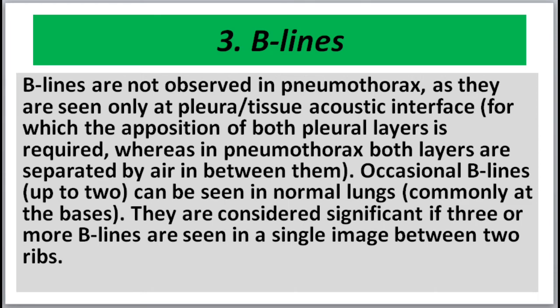B lines are not observed in pneumothorax, as they are seen only at a pleura-tissue acoustic interface, which requires apposition of both pleural layers. In pneumothorax, both layers are separated by air. Occasional B lines — up to two — can be seen in normal lungs, commonly at the bases. Three or more B lines in a single image between two ribs are considered significant.